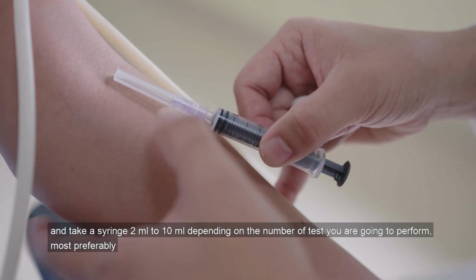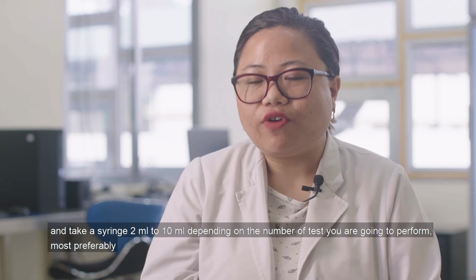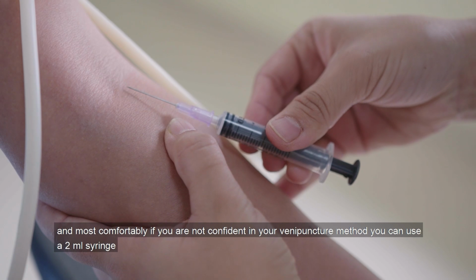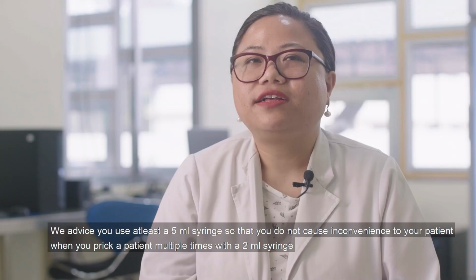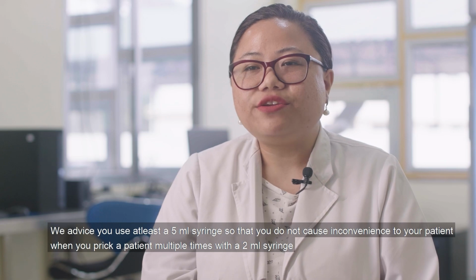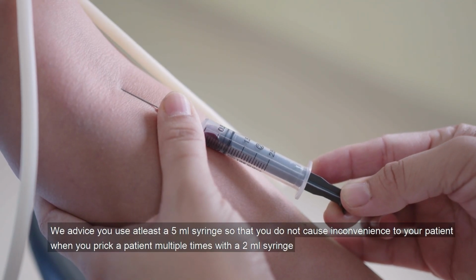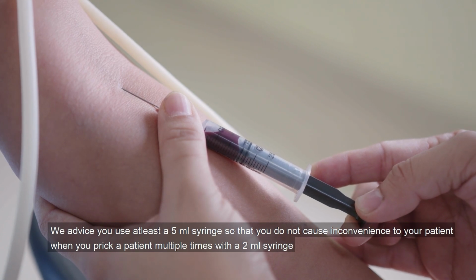Take a syringe, 2 ml to 10 ml depending on the number of tests that you're going to perform. Most comfortably, if you are not confident in your venipuncture method, you can use a 2 ml syringe. We advise that you use at least a 5 ml syringe so that you do not cause inconvenience to your patients when you prick a patient multiple times with a 2 ml syringe.